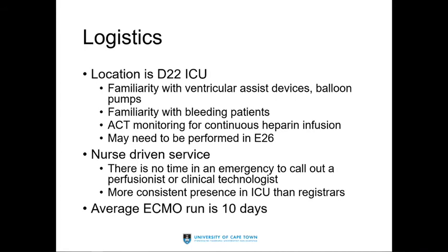Our logistics, we run it in D22 ICU because that's the cardiothoracic ICU, used to be before COVID times, and they have familiarity with ventricular assist devices, balloon pumps, they have familiarity with bleeding patients. You need to monitor ACTs with continuous heparin infusion. We do offer it in E26 as well, and have transferred staff up there to look after patients who have CREs or developed CREs during their ECMO run.